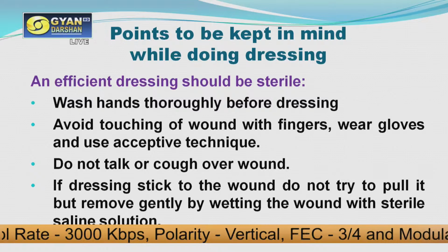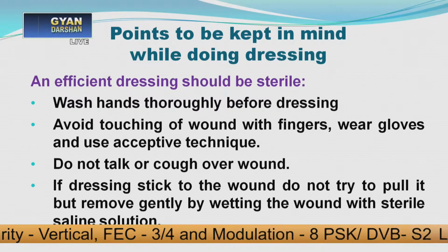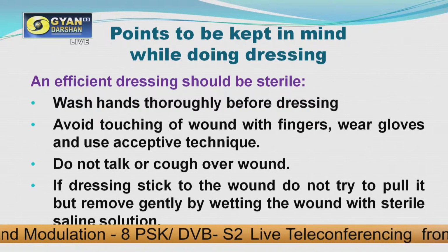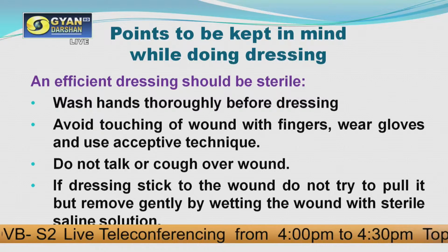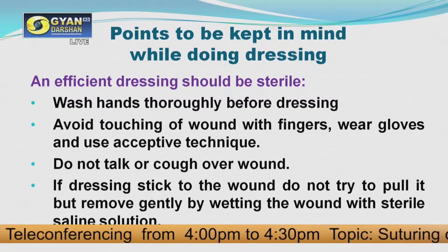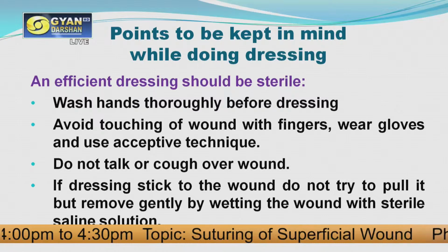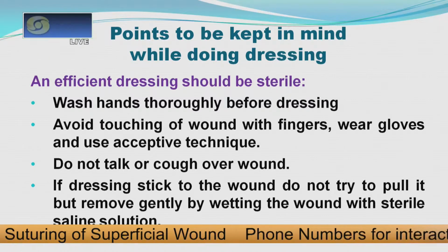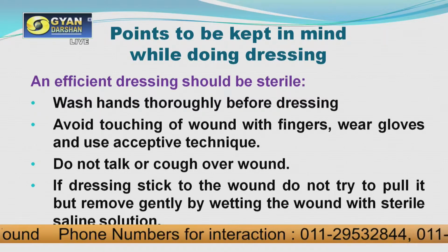That is why we say, even if your hands are washed many times, they remain dirty for the wound, so you need to wear gloves and use aseptic technique. Do not talk or cough openly over the wound. If you are coughing or sneezing, it should not be on the wound, as it can give additional infection.